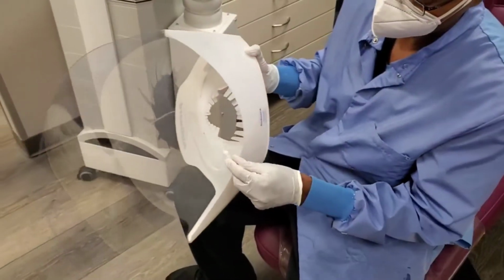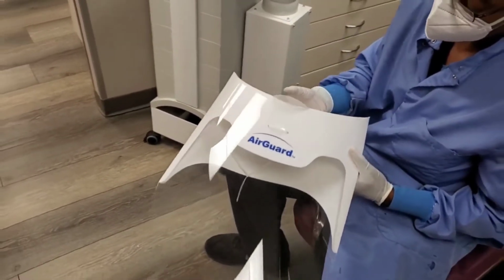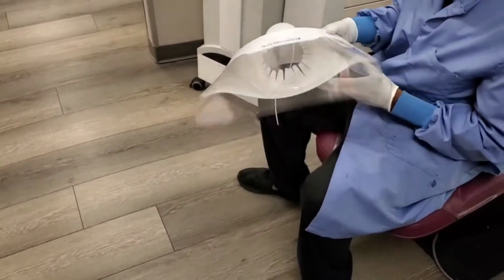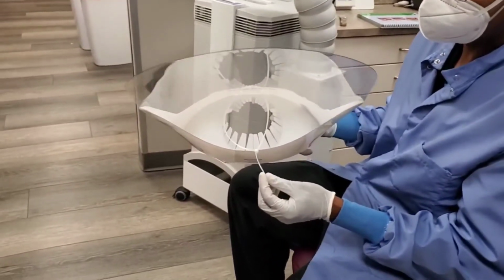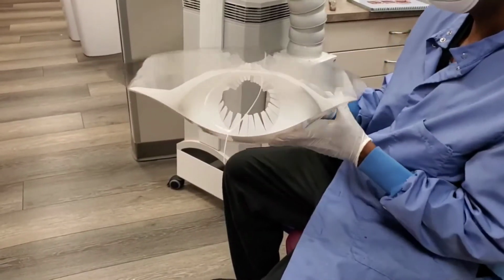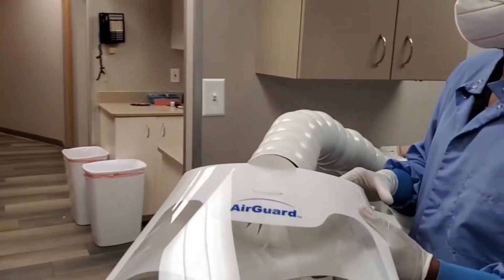I already have put the zip tie in there. So this is the best way. You want to thread the zip tie to the two openings right above the AirGuard logo, and then I already close the zip tie up just a little bit. It makes it easier. It's like a lasso basically. So then all you have to do is just slide it on.